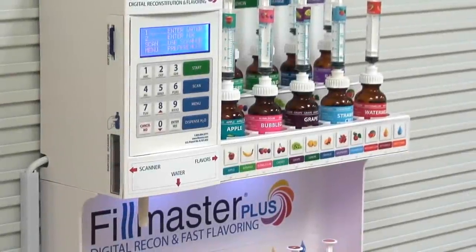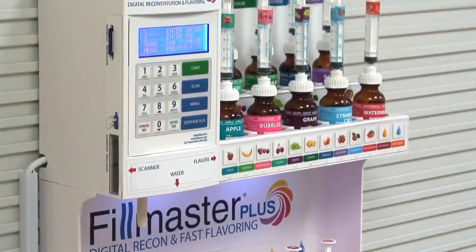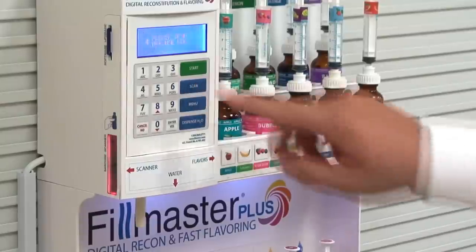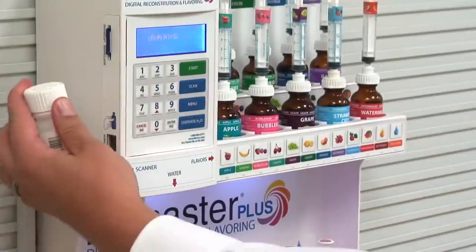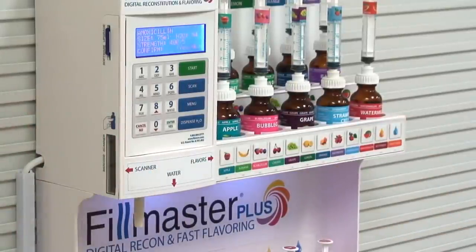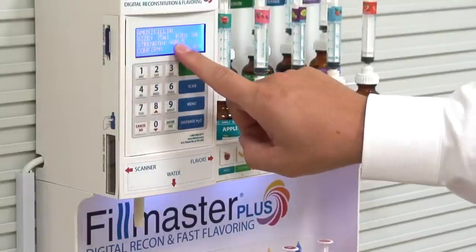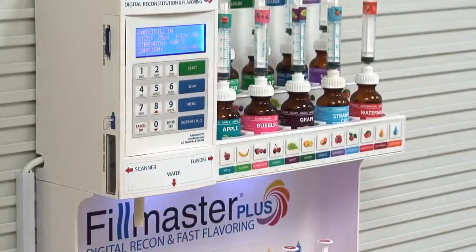The Filmaster Plus makes reconstitution fast and easy and also reduces the risk of dispensing errors. To begin, simply press scan and scan the barcode of the medication you'd like to reconstitute. The machine lists the drug name, volume, and strength to confirm you're dispensing the prescribed medication. Press yes to continue.